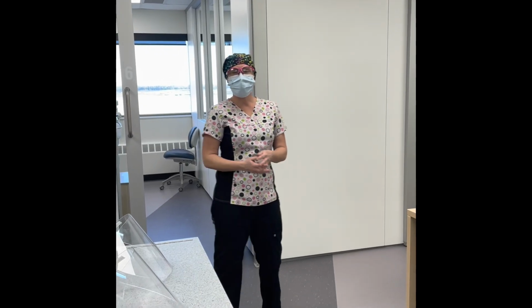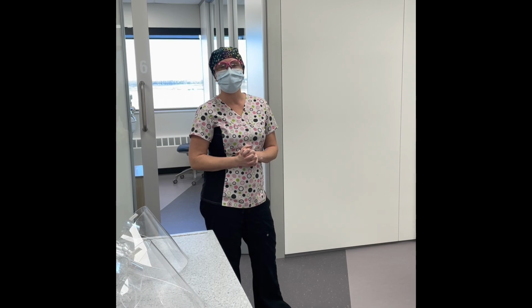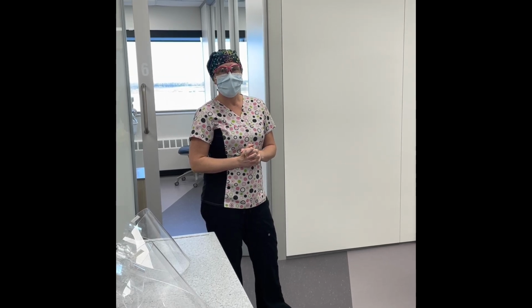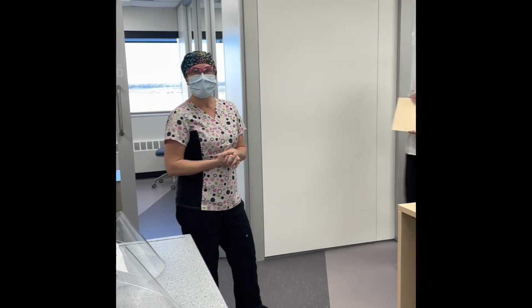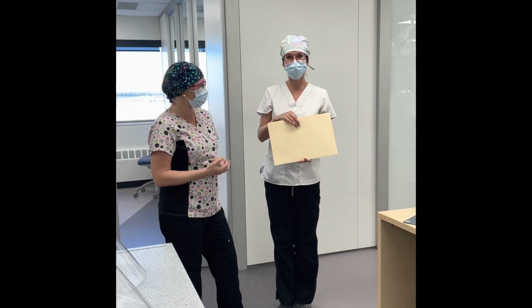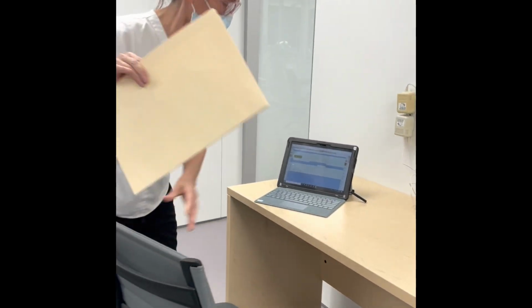Okay, everybody, so today we're going to do a demonstration for DNTL 169, Learning Outcomes 8 and 9. I'll be the operator in this situation, and Stacy's going to be my fabulous assistant. First thing you're going to do is get your chart. You're going to come in and review that at the desk here at the tablet, okay?